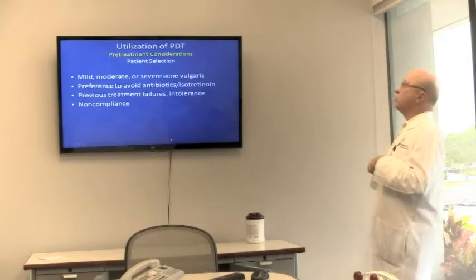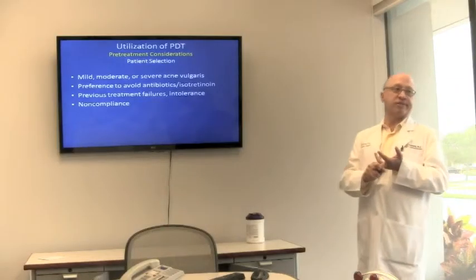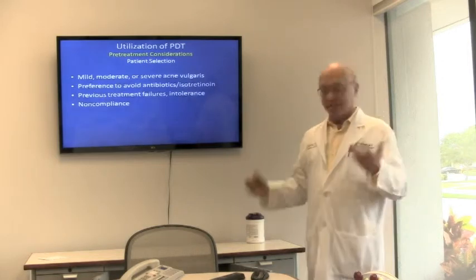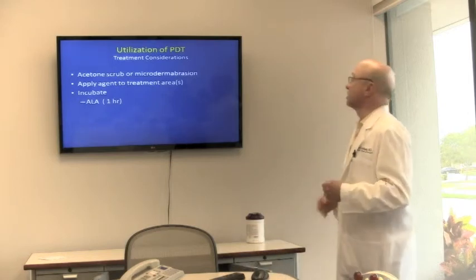And so who do we choose for this when we use PDT? Generally mild, moderate, or severe acne, and that patient who either personally or whose family doesn't want to use antibiotics or Accutane, and/or previous treatment failures, intolerance to antibiotics, you know, either stomach problems from the antibiotics, which happen all the time, women with their yeast infections, so these are all the people who tend to want this. And you know, people are humans, and humans are notoriously non-compliant. And this is an easy thing to be compliant with. You just show up once a month, and that's really what it is.